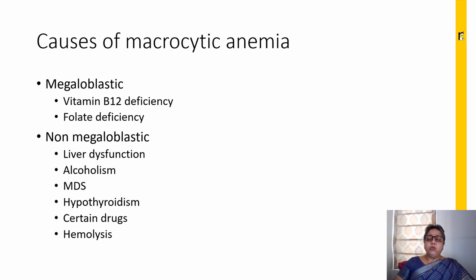Now, will we be able to distinguish the etiology of macrocytic anemia just by looking at the scatter? Well, to a small extent, yes, so that we could go further and do the right kind of tests which will lead us to the diagnosis. Just by looking at an MCV of 100 or 120, we will not be able to come to the diagnosis. Of course, looking at the peripheral smear is going to give you a lot of insight. But will the scatter give us some insight just like the peripheral smear would? Yes. Let's try if we can decode the scatter.